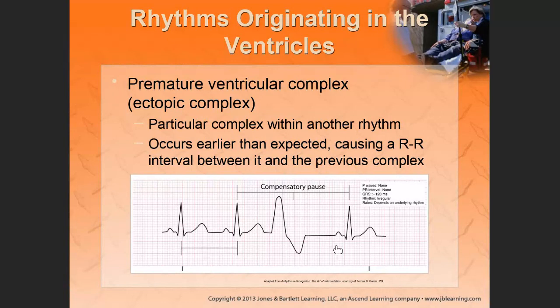No. No, there is no consistency, right? Here is a P wave, and if I mark off this P wave and this P wave on a paper and move it down where the next P wave should be, it's not there. It's not consistent, right? So there is inconsistency here. There is something going on right here.